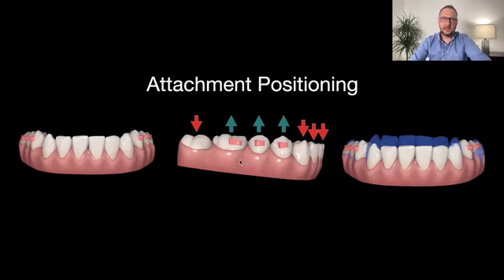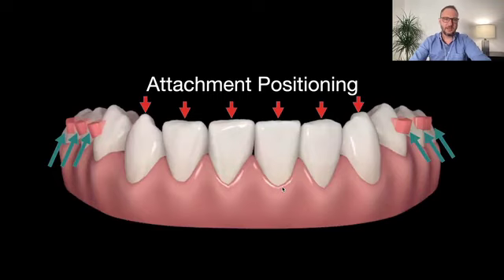And this is the ideal set of attachments for this case, okay? Where we are placing these rectangular attachments on the teeth that we want to extrude, okay? And this bigger surface down because the force is going up, okay? And with this strategy, we can increase a lot the predictability for this kind of correction, okay?